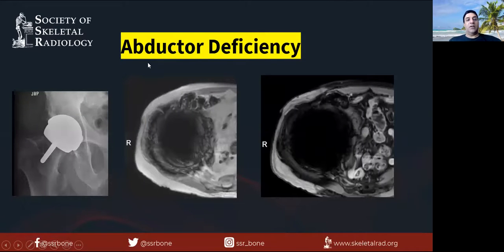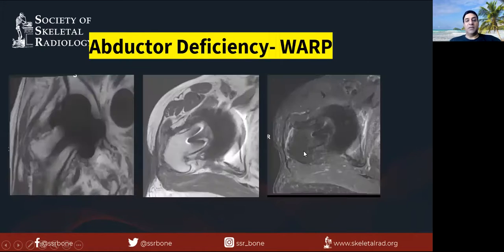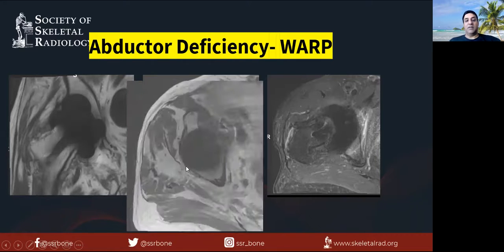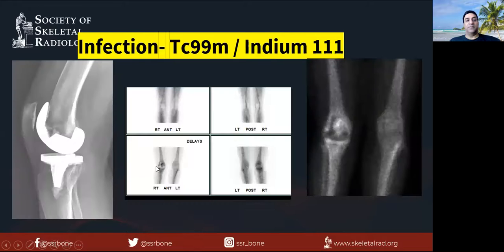One can also find abductor deficiencies as a cause of symptoms. Here's a metal-on-metal prosthesis with a lot of artifact on frequency-selective images. With the WARP sequence, you can see the areas around the metal — these look okay with no particle disease — but the abductors are missing. The gluteus minimus is absent and part of the medius is missing, representing abductor tears with muscle atrophy.